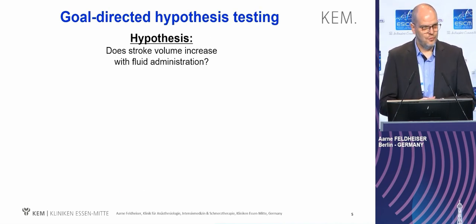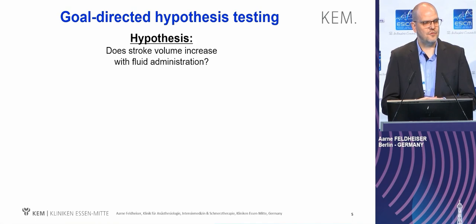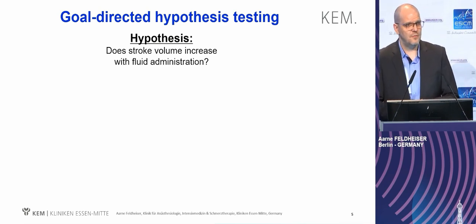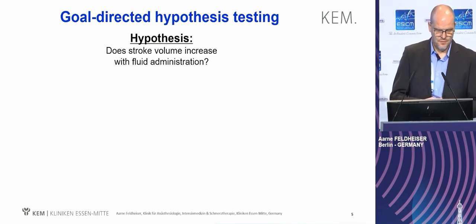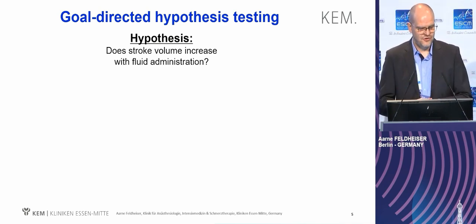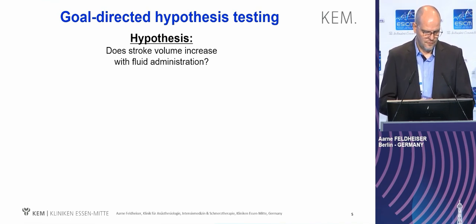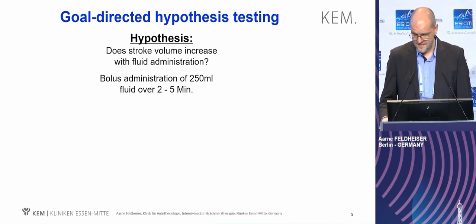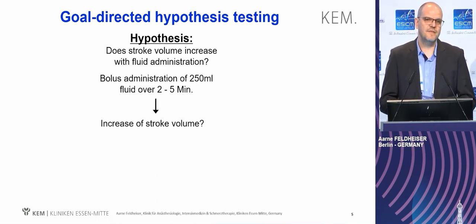Based on these monitoring devices, how do you do goal-directed therapy? You do a testing, and this is something I want to pass on to you, that you ask the question: does stroke volume increase with fluid administration? You just do the testing, you do the intervention, and then you measure stroke volume before and after.